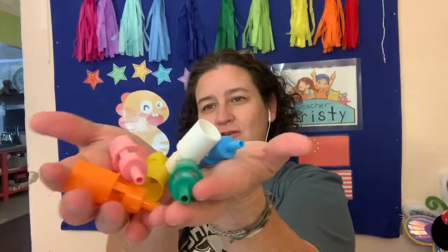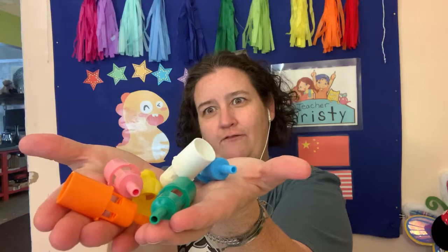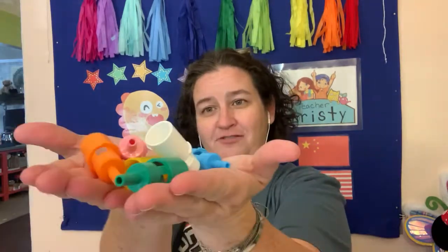The Venturi device is a variable orifice, and it depends on which one of these we use. They're so colorful. I might keep these for my classroom. Orange. Yes, because if you haven't figured it out, this is where I teach Chinese kids English. Yeah, my favorite prop to use, Mr. Potato Head.